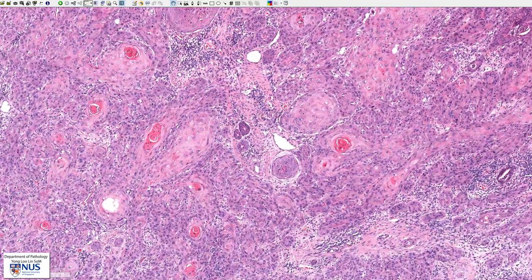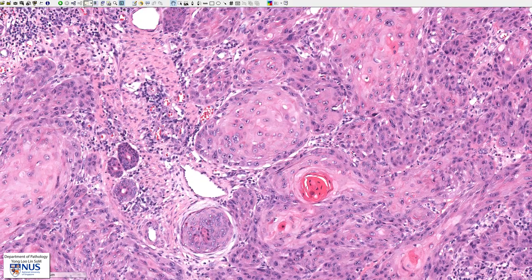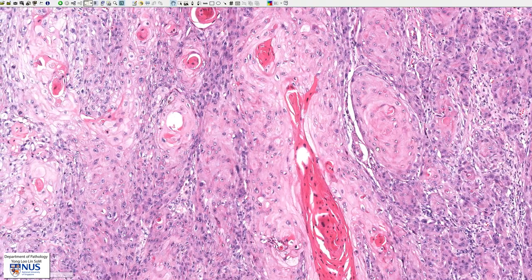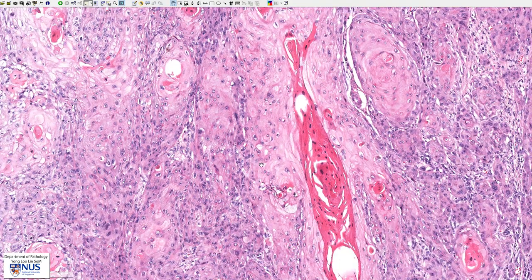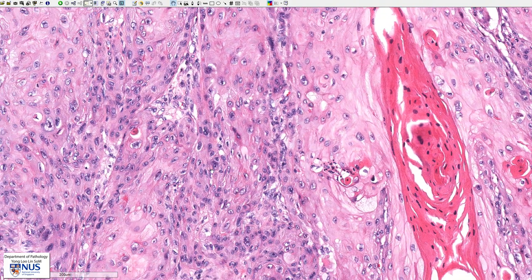The cells themselves show some degree of nuclear pleomorphism, with enlarged nuclei with prominent nucleoli, as well as some nuclei that are not so large and with less prominent nucleoli. We can appreciate this pleomorphism as we move around, with some large nuclei and other nuclei that are smaller.